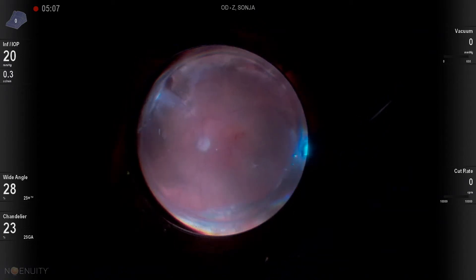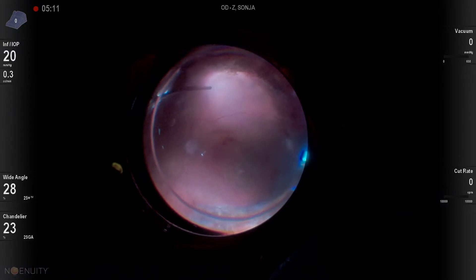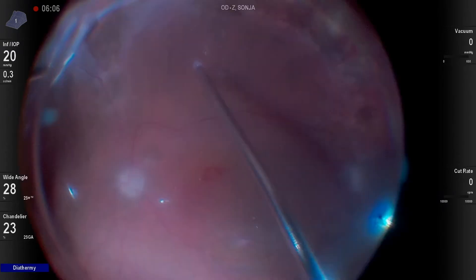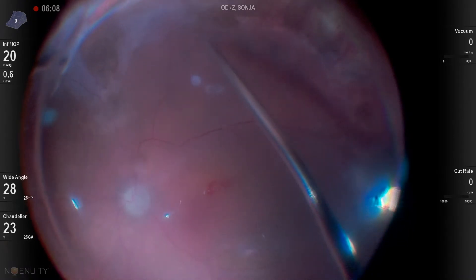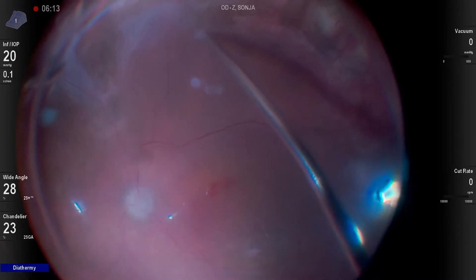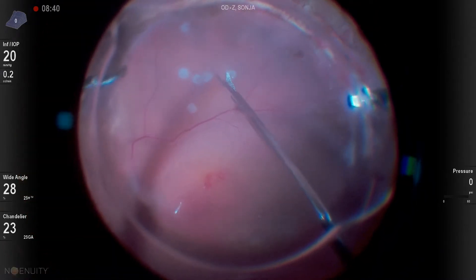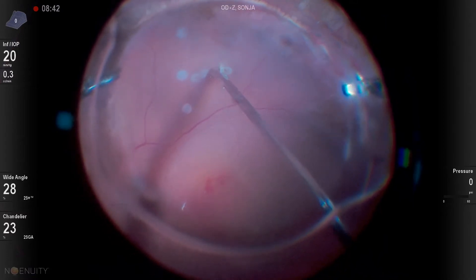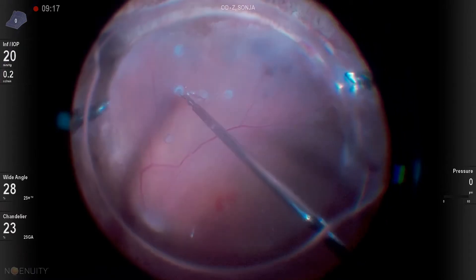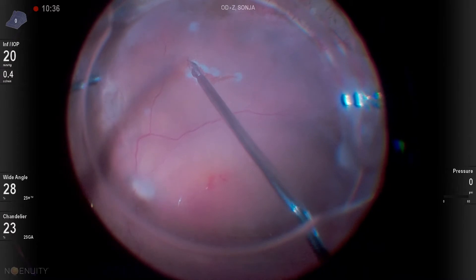One of the most interesting and creative cases I've done in the last couple of years was this patient. She was unique in that she had a recurrent detachment under silicone oil from PVR and a small full thickness macular hole. We decided to take a retinal transplant from the area of her inferior detached retina that we were planning to do a retinectomy on, and utilize that as an autologous transplant site.